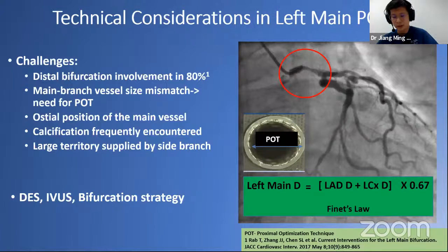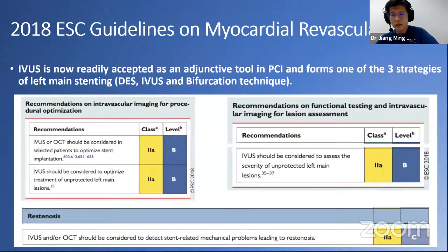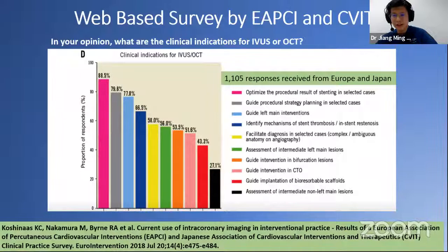So in order to overcome these technical challenges, optimal PCI is necessary to improve clinical events. This will include the use of intracoronary imaging such as IVUS, the use of appropriate bifurcation technique, and optimal DES. Now, IVUS is readily accepted as an adjunctive tool in PCI, as seen in this case here. According to the latest 2018 ESC guidelines on myocardial revascularization, IVUS is considered a class 2A recommendation in selected patients to optimize stent implantation, to assess the severity of unprotected left main lesions, and to optimize treatment after stenting.